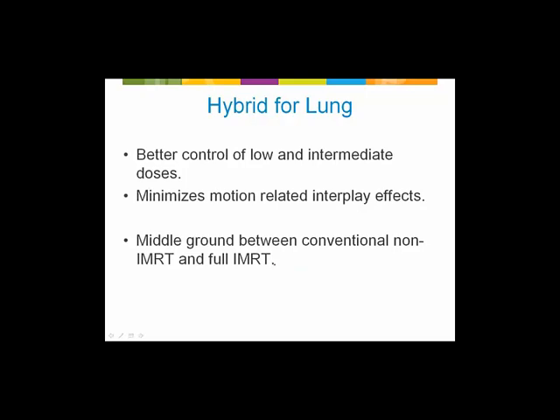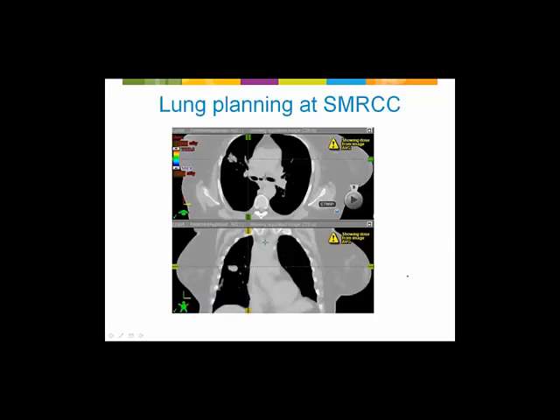Now, as we scroll up through the distribution through the thorax, one characteristic you see in these volumes is that they can be very long, depending on the amount of mediastinum involved. And this is what creates all of our problems for trying to control V5. Because remember, what the beam sees, the patient gets. So unless the volume is a little shorter, it can be hard to control that.